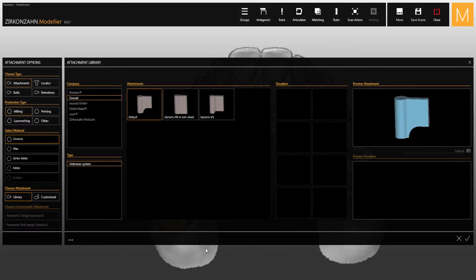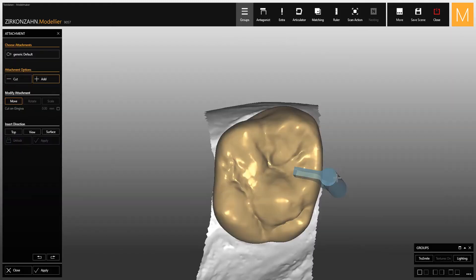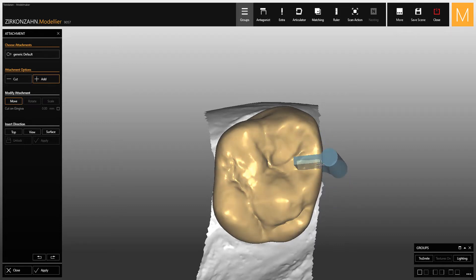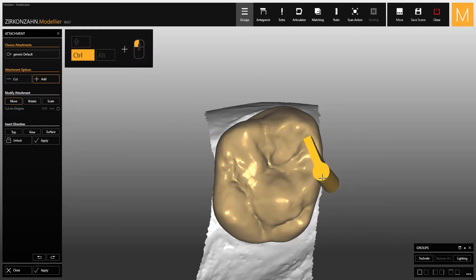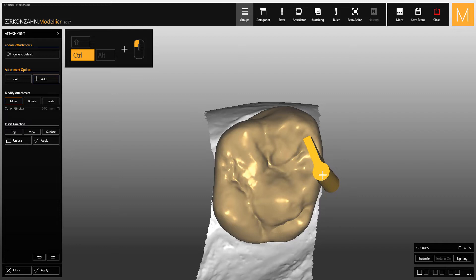Concerning attachments, after selecting the desired one, click on the tick at the bottom right corner to proceed with the placement. Attachments can be placed by clicking on the structure with the left mouse button. Then you can modify them using the move, rotate, and scale options. There are also different shortkeys to move and rotate the attachment.